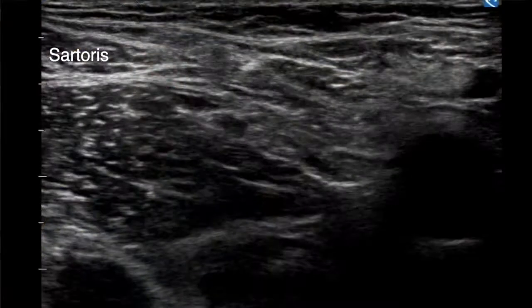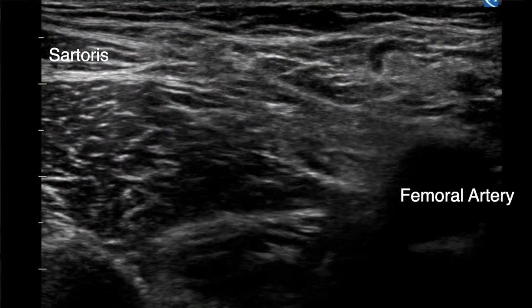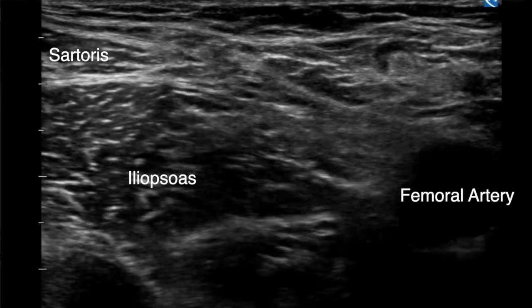We perform the fascia iliaca block with placement of an ONQ catheter utilizing the lateral to medial approach at the level of the femoral crease. Here, we can visualize the sartorius muscle in the superficial and lateral position, the common femoral artery in the medial position, and the iliopsoas muscle with its overlying fascia in the deep position.